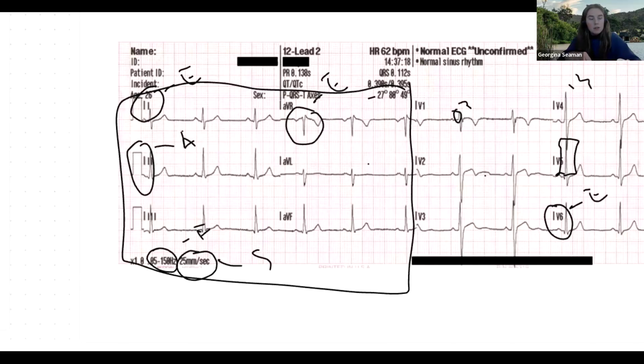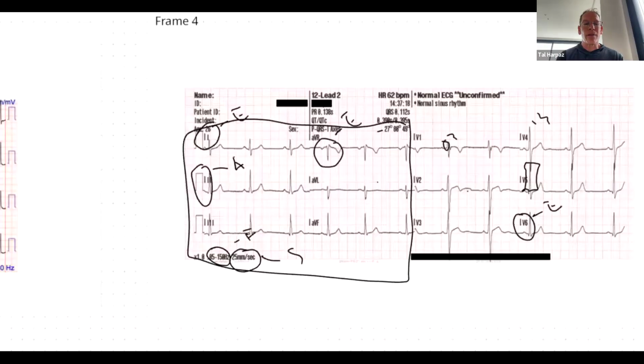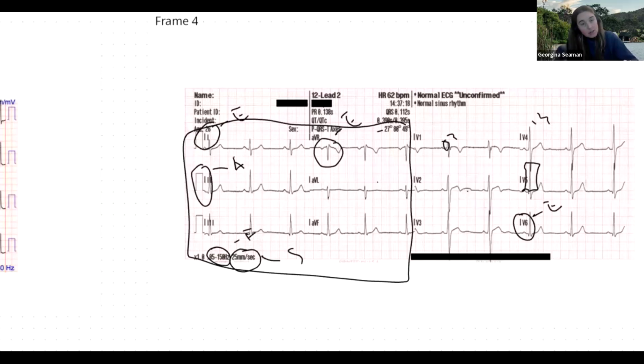Carl, maybe I can go into your question and then see if that helps as well. So you mentioned that you're only seeing the left ventricle. Does anything allow you a view of the right ventricle or the atria? Not really, no. If there's anything wrong with the other parts of the heart, we can't tell directly. We do a V4R, so we potentially remove V4 and put that over onto the right side of the heart, and we can see V4R from there.